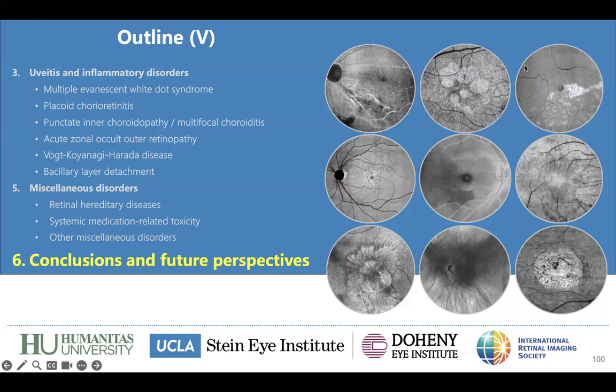I saw several ways of clinical application of en face OCT imaging, and I don't know if I missed something, but every en face image that you show is based on the highest reflective point of the OCT image, correct?